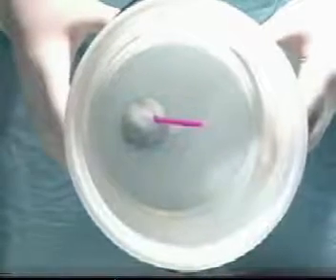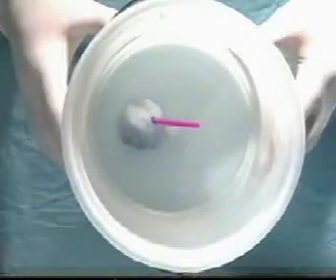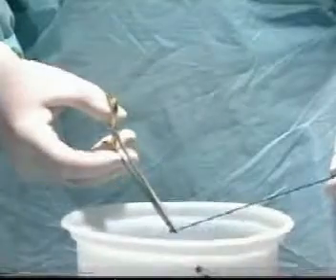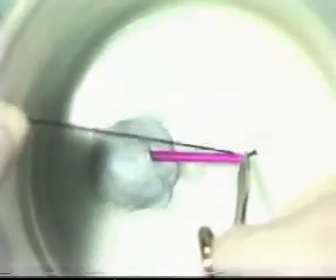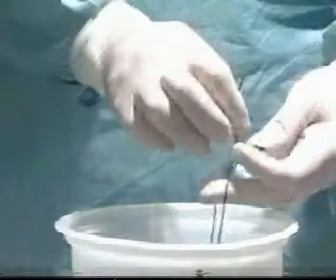Let's look at a model for tying at depth in the pelvis. You see here a simulation of a small blood vessel deep in the pelvis, made from a straw and a blob of blue tack. Take your suture material in the tip of a hemostat and pass it round the blood vessel, taking great care not to exert any tension.